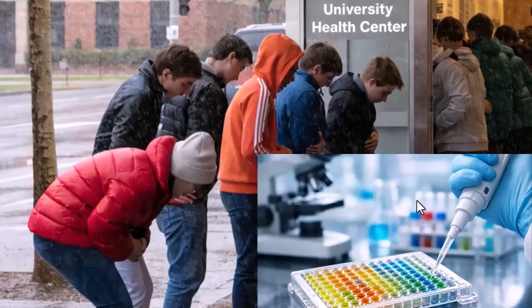Which limitation of toxin ELISA is most likely to produce a false positive result? High sensitivity, matrix effect, cross reactivity, and limited toxin scope. True or false, toxin ELISA can detect multiple different toxins in a single test. False. Each kit is designed for a specific toxin.